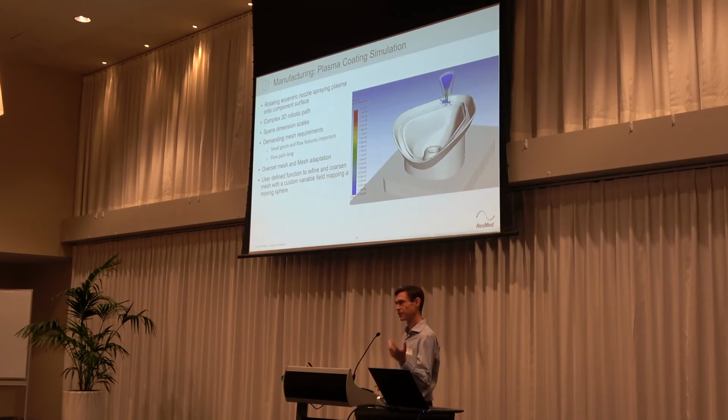And then we needed to have this thing moving, and so time and dimensions conspired against us. If you were to just have a static mesh for that, it would have been unsolvable. So we ended up using an oversetting mesh technique. We had two complete overlapping volumes with an interface region combined in Fluent, and then one was allowed to move across the other.